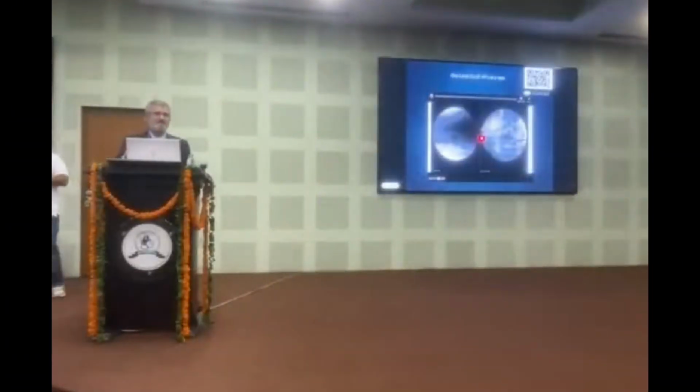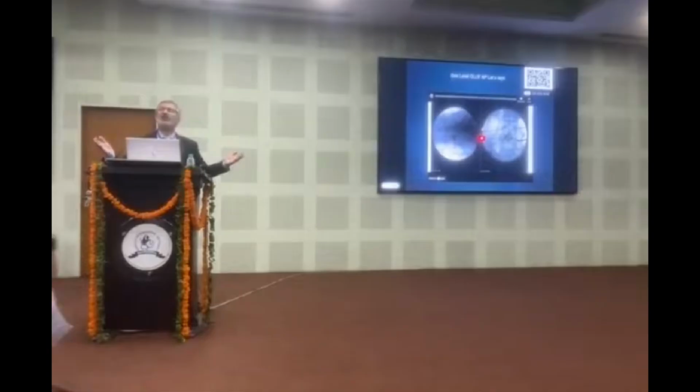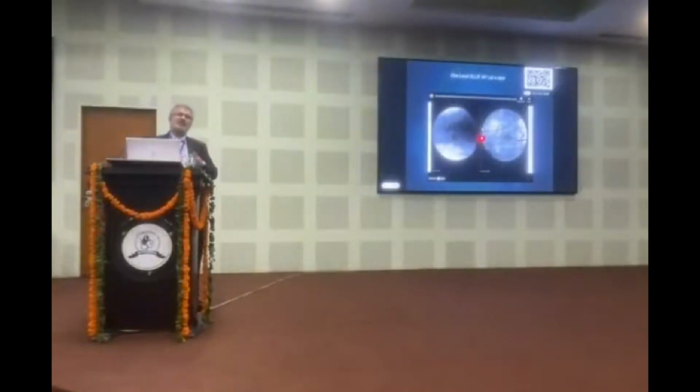So you have both monopolar or bipolar monitoring. This is a monopolar. Any monitoring, any probe, any electricity is always bipolar. It's just a question about where the two poles are. For practical purposes, this is a monopolar because the other pole is down in the legs. I put electricity and I see it close to the nerve. The other pole is the muscle that starts stimulating. The electricity passes through this probe and a neutral probe somewhere in the skin.